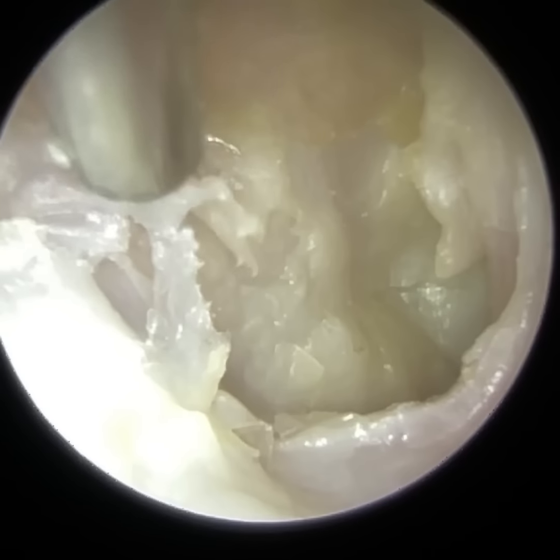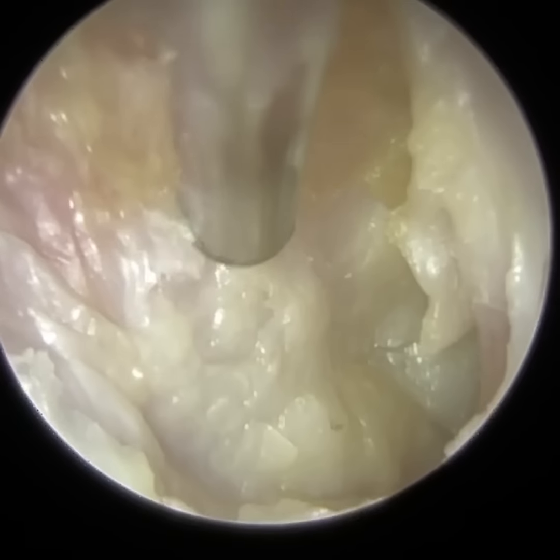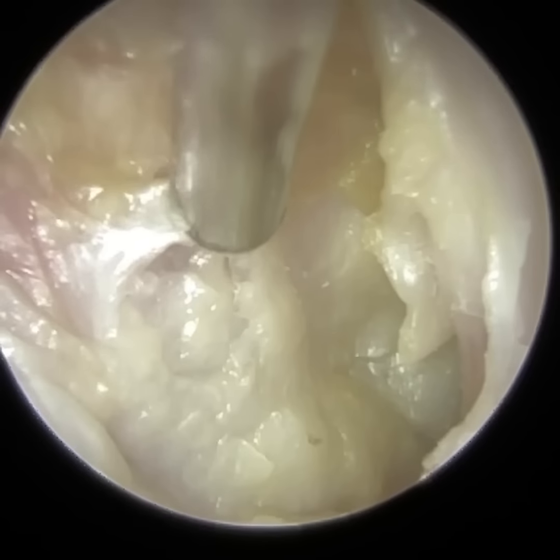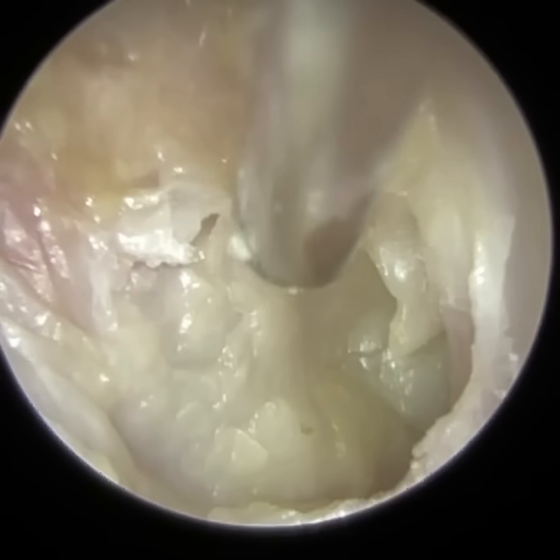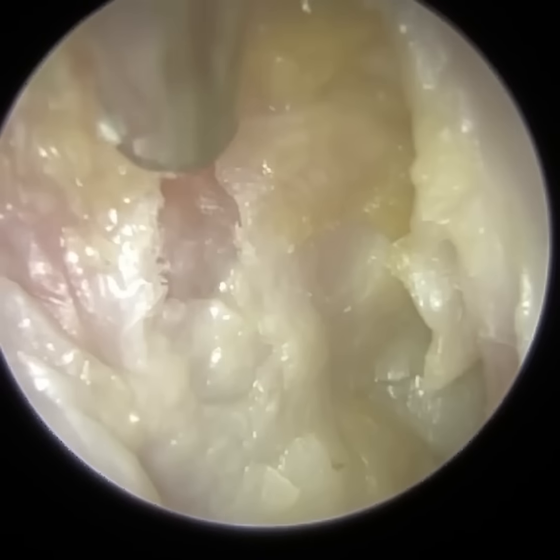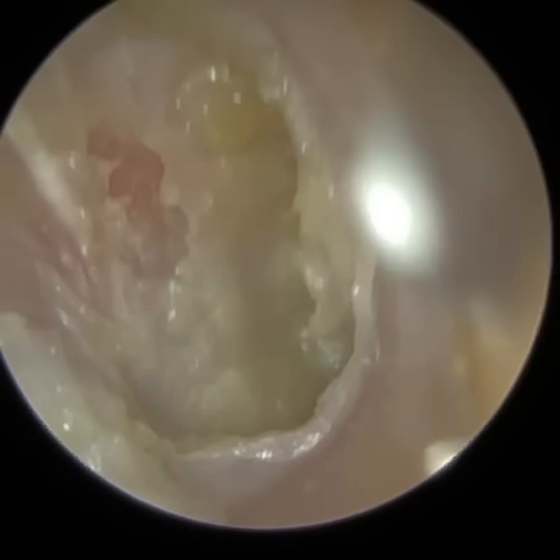So our ear canal has two recesses. Normally we have an anterior recess and an inferior recess. As the ear canal extends to the eardrum, about 0.5 centimetre away, it narrows and then widens, and when it widens, in the case of the right ear, it widens to the right hand side of the ear canal towards the eardrum, so that creates a recess there, and also it widens inferiorly at the base of the ear canal, so you almost have a base and a trench there as well. And by angling the fine end, it just allows better access, particularly in the anterior recess, and it's trying to keep away the suction tip from the bony part of the ear canal.